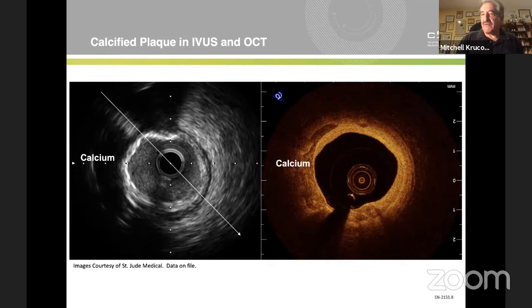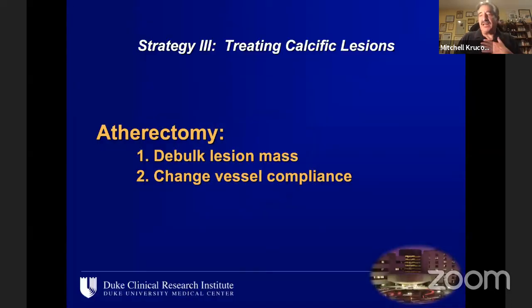But if you use intravascular imaging, either IVUS or OCT, sometimes the challenge is to get the imaging device through a diffusely calcified vessel so you can actually get an image. But there is no question that when you use intravascular imaging, you see calcium, even severe calcium, that is not visible on a simple angiogram. And that's particularly true in Western populations like the United States, where people are fat, because the gray scale that we use for angiography hides calcium when people have a lot of tissue. So intravascular imaging adds greatly to that.